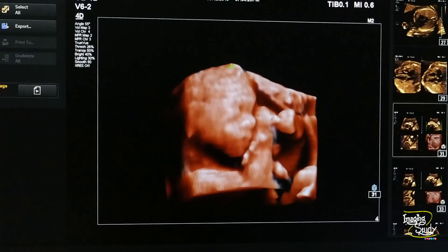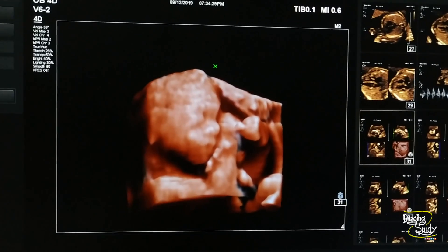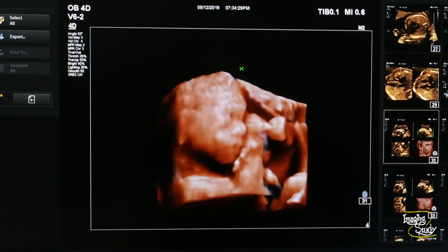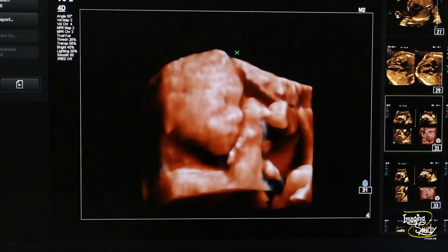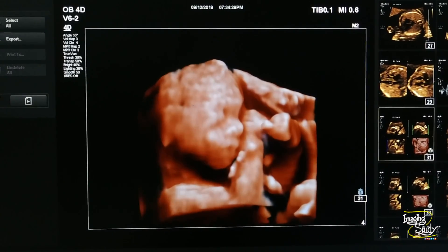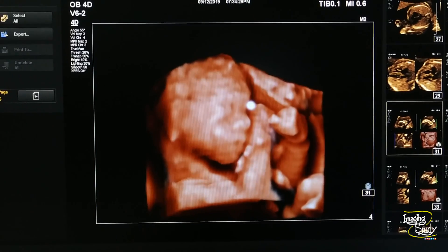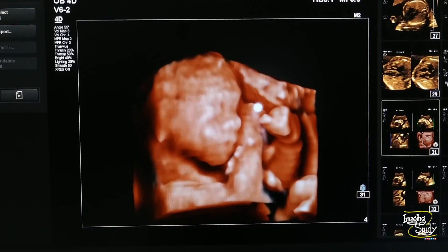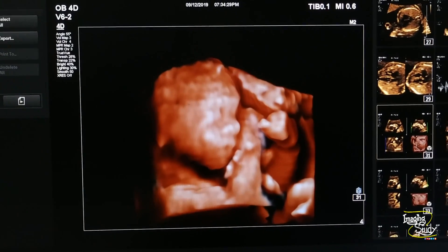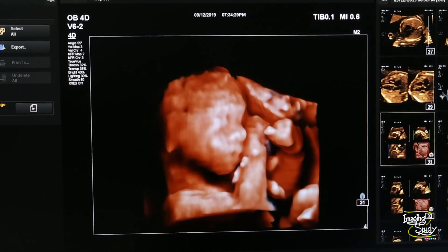You can see the fetal hand here. I'm changing the threshold — I use the threshold button a lot; it might be labeled as threshold or density on your machine. I'm also changing the light source. There is a light source button which lets you change the direction of light, and this can give you a better result. Every time you get a good image, save it, because sometimes you get the best result at a particular lighting condition.